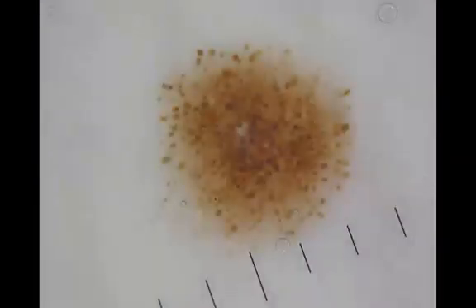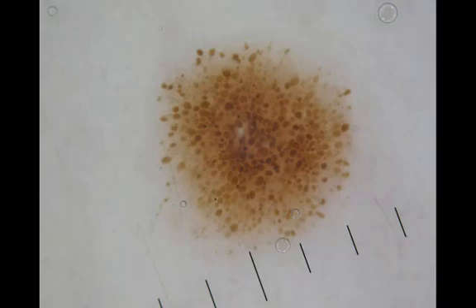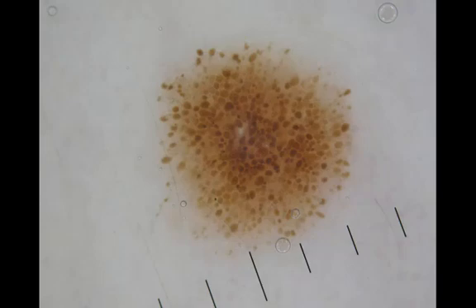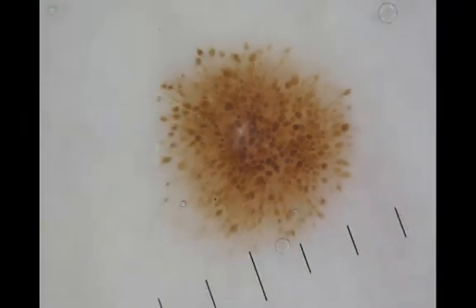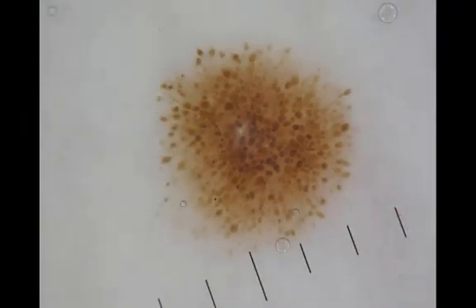Here is a lesion clinically. Dermatoscopically: one pattern — brown clots. No chaos. There is one clue: a white dot, which is a clue to a congenital nevus. The diagnosis is small congenital nevus.